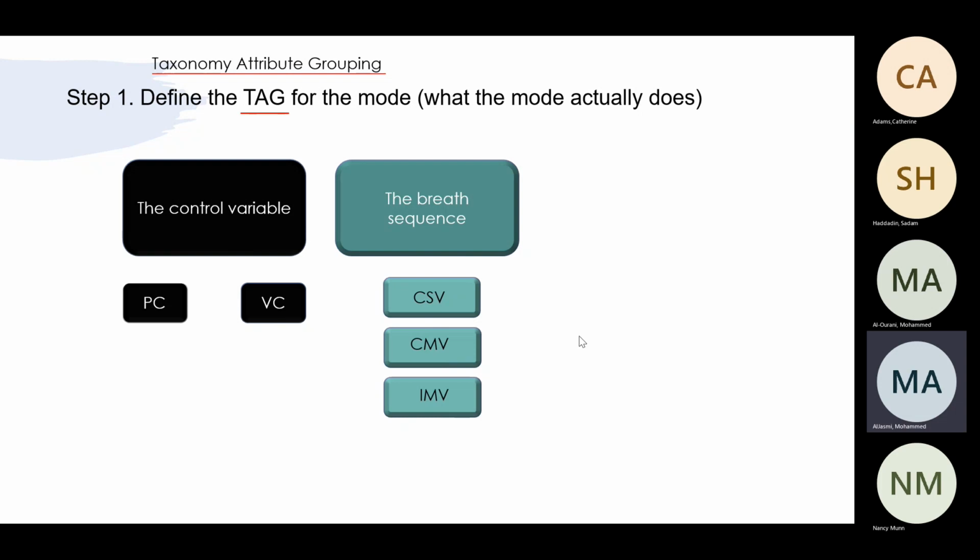But in intermittent mandatory ventilation, there are multiple types, but just a quick review. Let's say I have a patient on mechanical ventilation who is breathing spontaneously, and I put the machine on 14 breaths per minute. The patient will have his spontaneous breathing, which will look like PSV because the patient is initiating and the patient is ending, is that right? And every so often some of the breaths will come as mandatory. It's weird, there's spontaneous and mandatory on the same screen. This is intermittent ventilation.